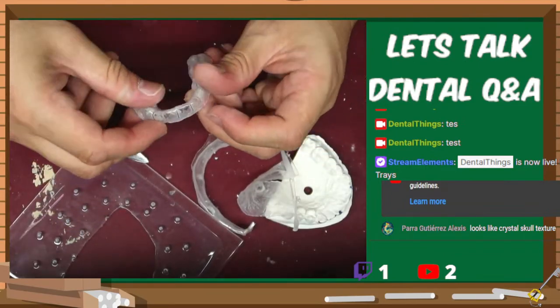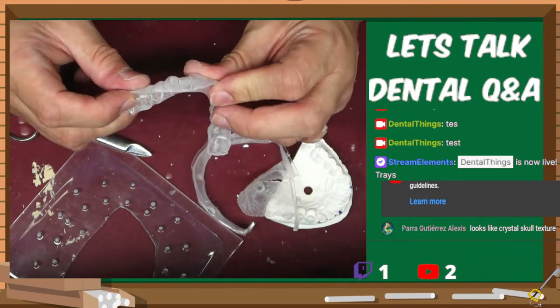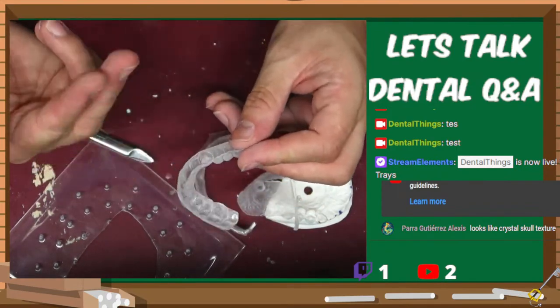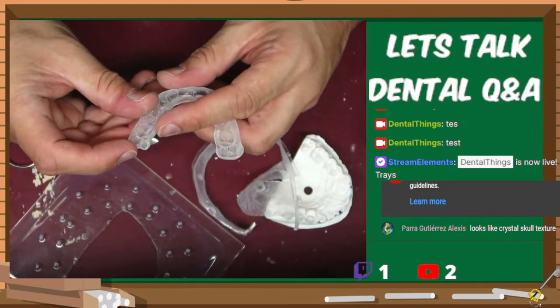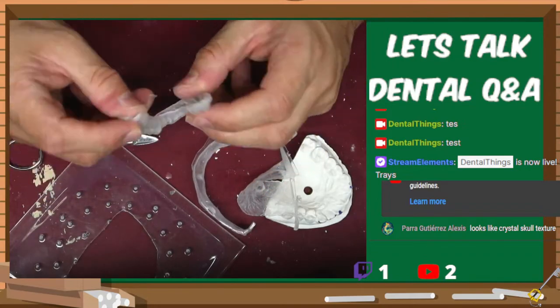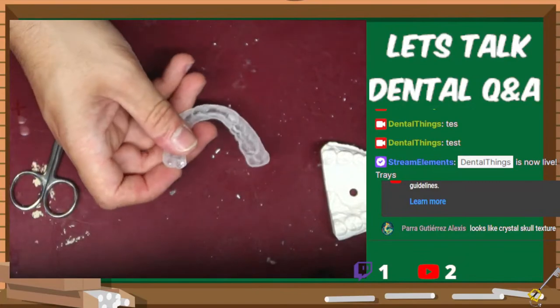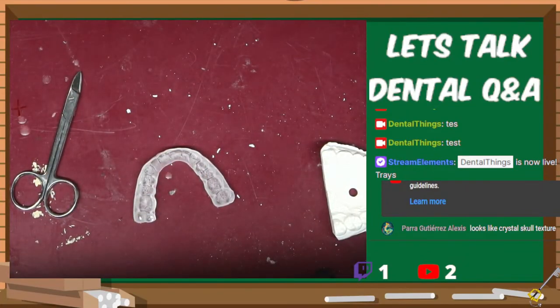And now we have this. Now right now it looks pretty, what's the word I'm looking for? It looks really frosty. It kind of looks too dirty. You can't even see through it or anything like that. So I gotta clean this up a little bit. I'm gonna go and hit some of these edges so that they're more rounded. Thankfully, because this is very rubbery, it really doesn't bother the patient too much. They might just feel extra little hairs or little cuts that are in the model.